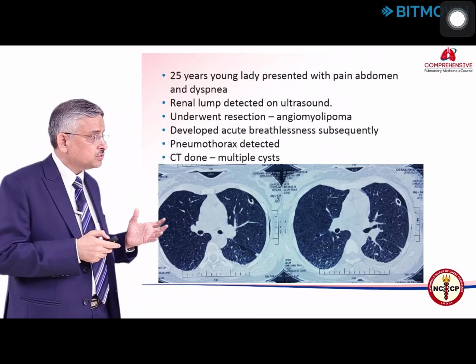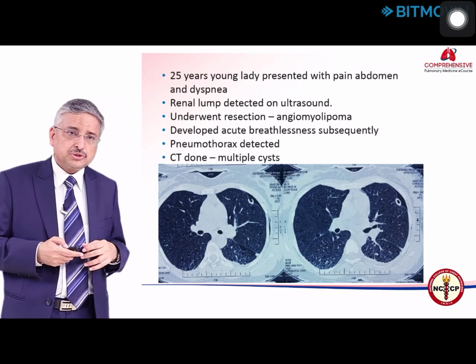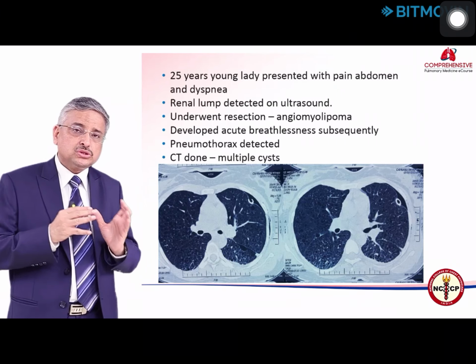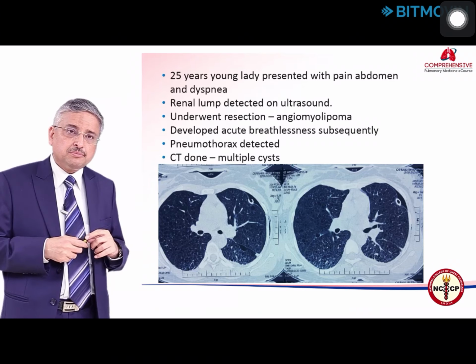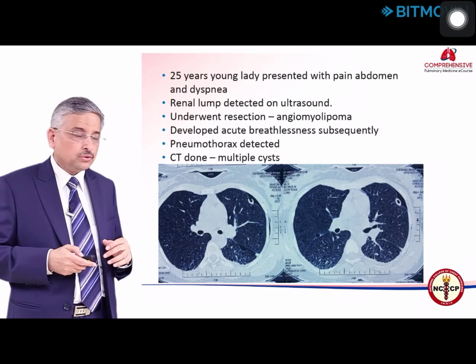This patient has lymphangioleiomyomatosis, and this is a classical picture that these patients have. The reason why it is very important is that these patients do very well with low dose sirolimus. So, you have a specific treatment for these patients with ILD, and therefore, diagnosing this is very important, because if you are treating them with steroids or immunosuppressants, they will not show a very good response.